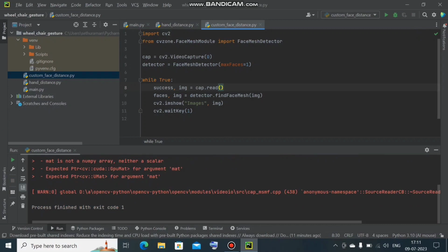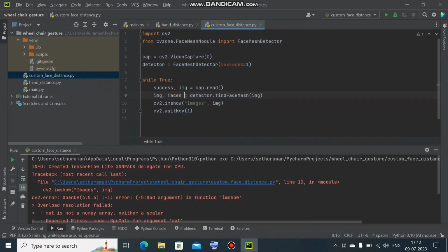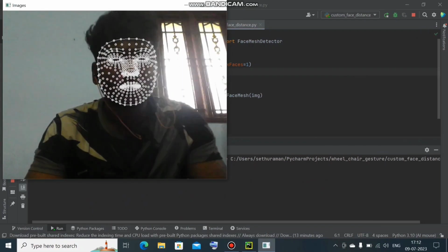Oh, I'm getting some error. Sorry guys, we just need to interchange this. Before, it was like this: faces comma image, but we need to put image comma faces. I guess now it will work fine. Yes, now it is working fine.